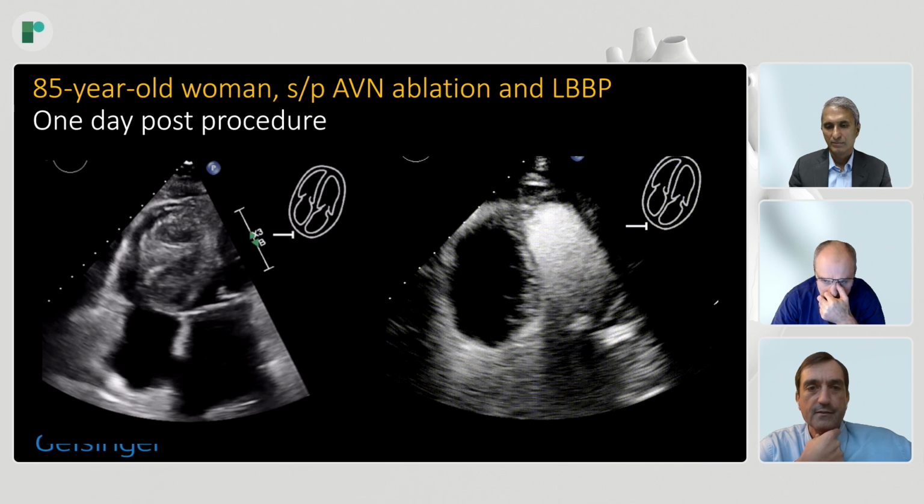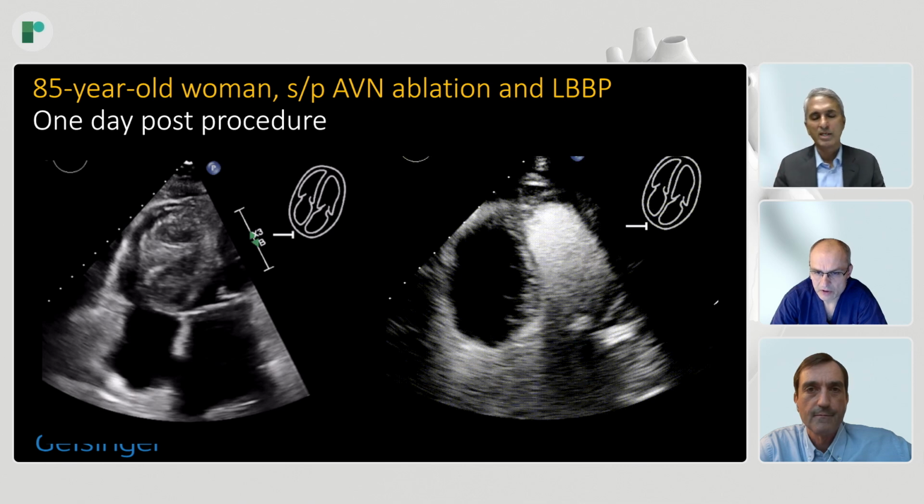But yes, it's a concern that we had to observe, especially when we are doing multiple attempts for lead deployment in the septum. So we have to check that everything is okay with the septum after the procedure. Marek, what would you do to avoid it? We have not seen cases like that in our experience, but I've heard about 2 cases from other Polish labs. So it's out there, and I don't know why we have not seen a case like that, although we do perform echo in our patients.